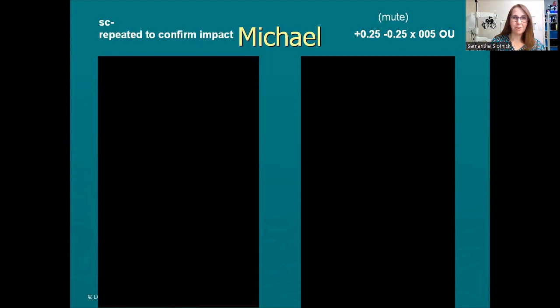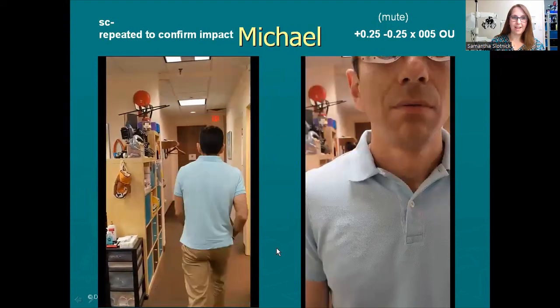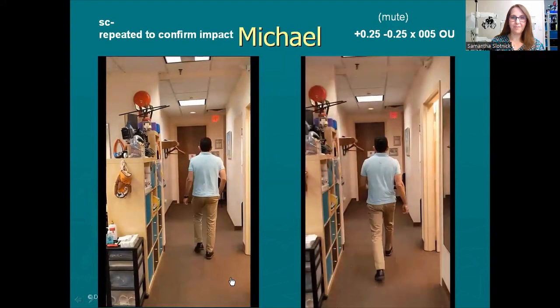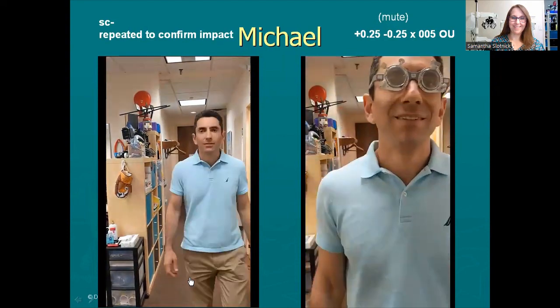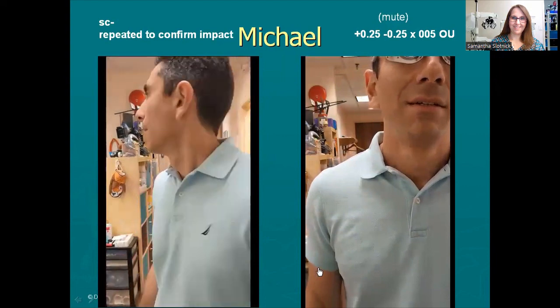And so to help him understand that this was a legitimate difference, we repeated the no prescription version, and I'll let you see that against the final prescription. It's like I want to slow down. Take your hand out of your pocket. You can take an extra lap if you want to see how do I really feel, like kind of walk it off.